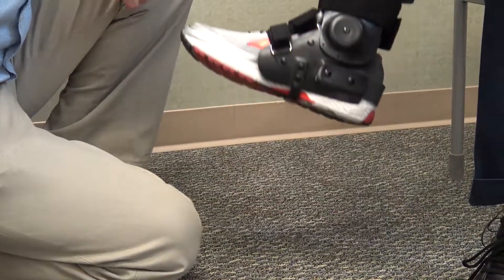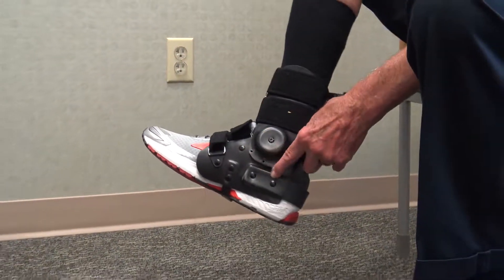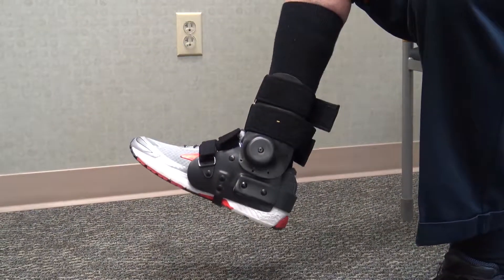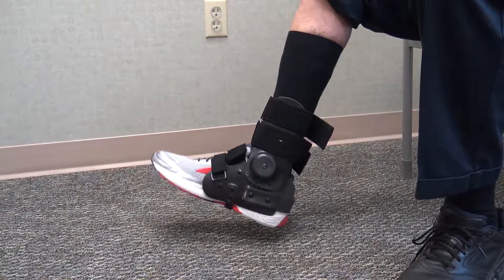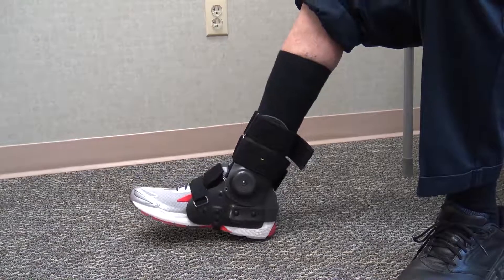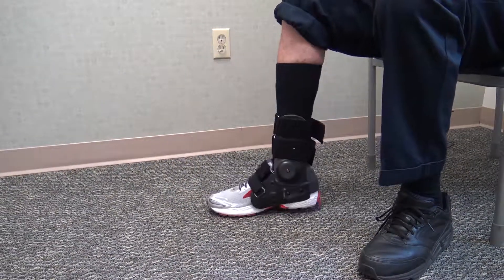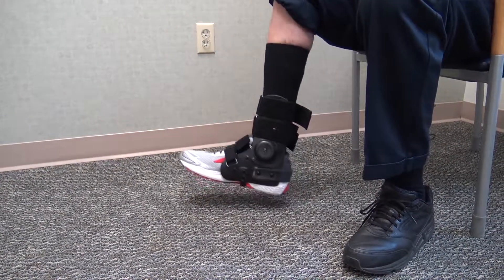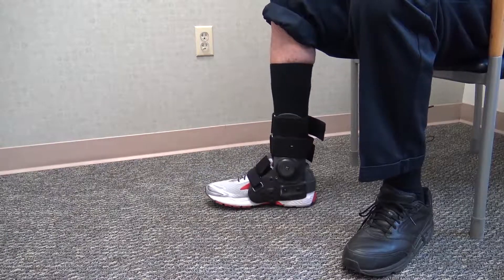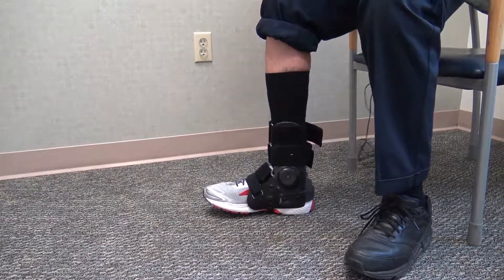This happens to be a range-of-motion one — we've taken the three screws out on the inside and outside; otherwise it'd be fixed. With range of motion, they can walk normally: heel strike, toe strike, toe off. With the locked one, you can't walk heel-toe because it's locked, so you walk with a flat-foot gait for total contact of the shoe.